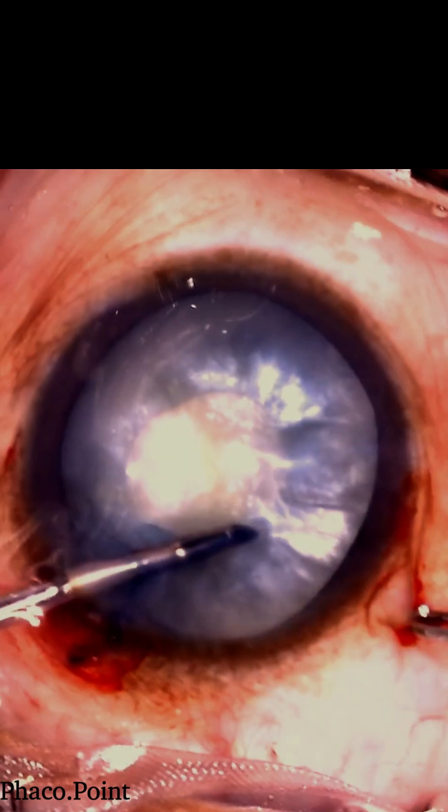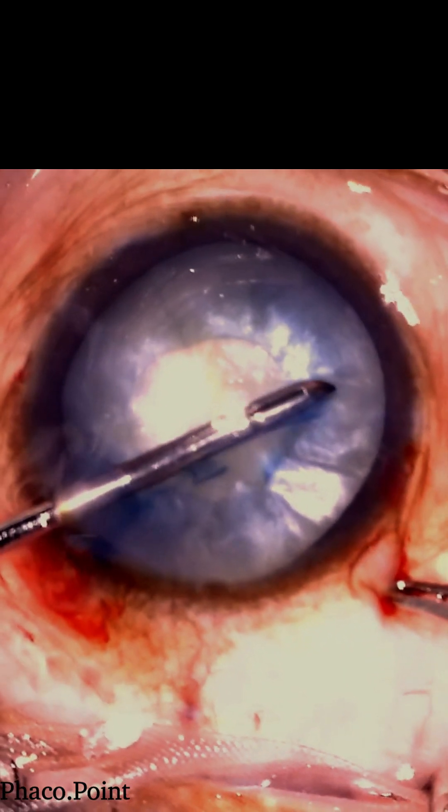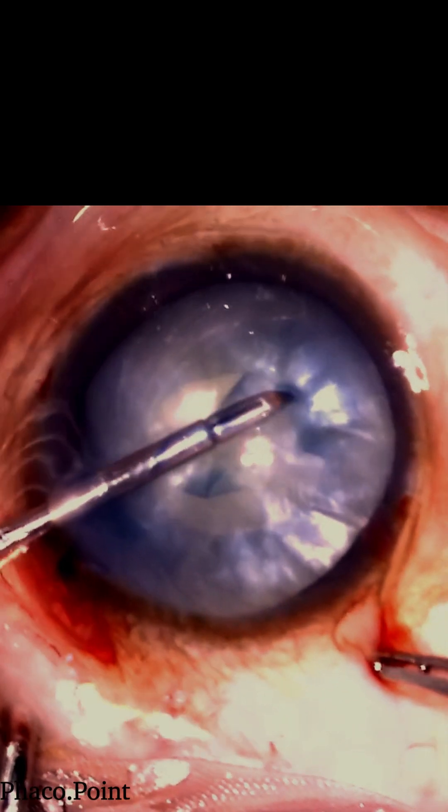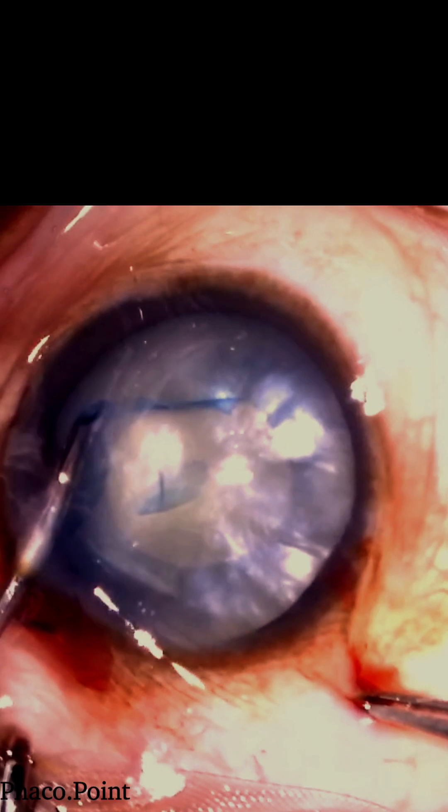Watch how it moves through two circles, the second larger than the first in a spiral manner, thereby resulting in enlarging the capsular rhexis to get it to the adequate size as demonstrated.